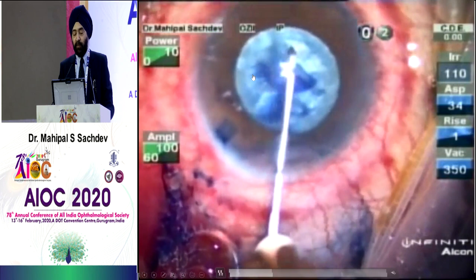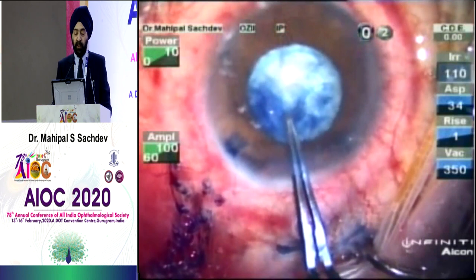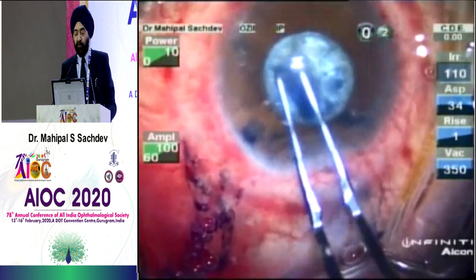that is coming here. Now, this is being perforated by the femtolaser like a postage stamp, and you can see that whatever adhesions were there, we have been able to remove. Now again, see that there is an adhesion here at the fibrotic area, this and this. So just go back from the other side, be a little careful and you will get a good capsulotomy.